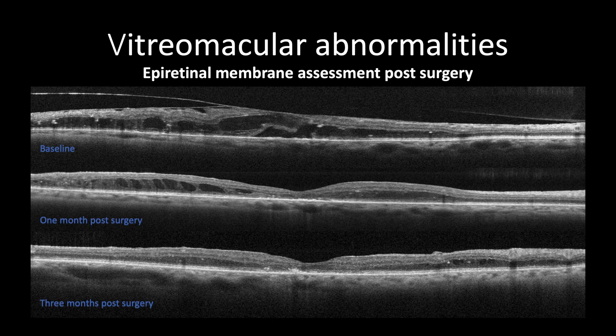In contrast, this case of diabetic maculopathy is complicated with broad vitreomacular tractions causing intraretinal cystic changes, macular detachment, and increased central macular thickness, as well as an epiretinal membrane which caused corrugation of inner retinal tissues. The best corrected visual acuity was counting fingers.